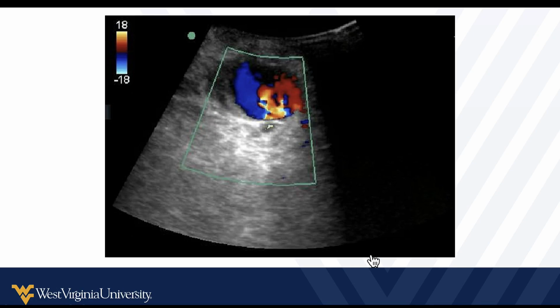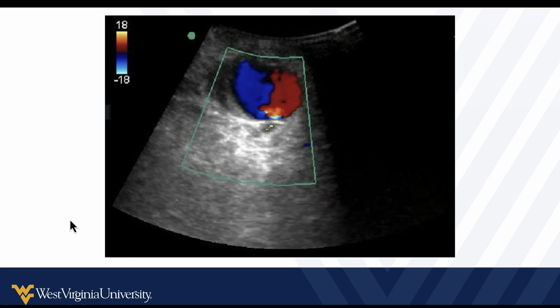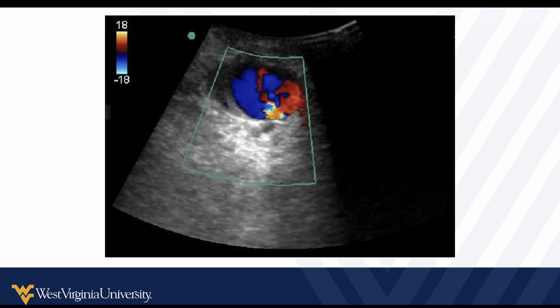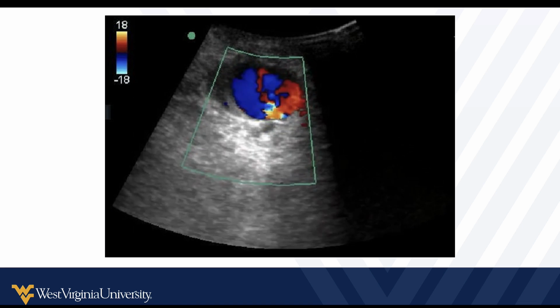Now, sometimes the patient points to an area, maybe in their groin or somewhere that hurts, and they say it's swollen and painful, and your first thought might be, well, maybe it's a hernia, or maybe it's an abscess or something like that. And ultrasound can be incredibly helpful in helping you differentiate what this swollen lesion is in their groin or in their abdomen or wherever it might be. In this case, if you thought it was an abscess, point-of-care ultrasound would change what you want to do with that. You certainly don't want to perform an I&D on this, and you're not going to try to reduce this quote-unquote hernia, as what you see here is clearly a pseudoaneurysm. We've got the femoral artery here. We see the classic yin and yang pattern of the blood flowing in and out of this pseudoaneurysm.